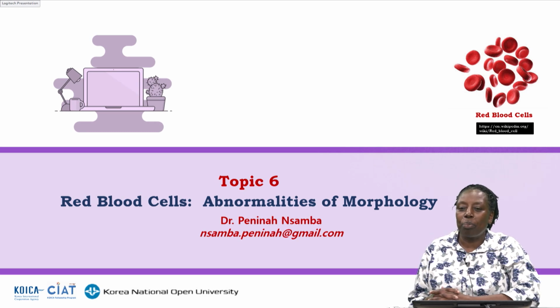Today we are going to look at topic 6, which is concerning red blood cells, and now we are going to dwell on the abnormalities of the morphology seen in red blood cells, and this is usually in a thin smear.